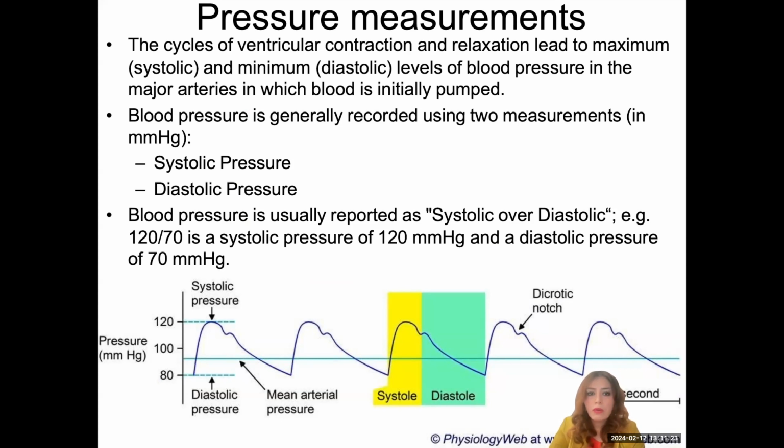Now, we have a pressure versus time graph for systolic and diastolic pressure. Let's make some explanation for these. This figure shows us the arterial blood pressure fluctuations, and as you see, we have 5 peaks. This figure shows us 5 arterial blood pressure beats, and some usual properties of these. Look at that. For one arterial blood pressure beat, we have a 1 second interval.